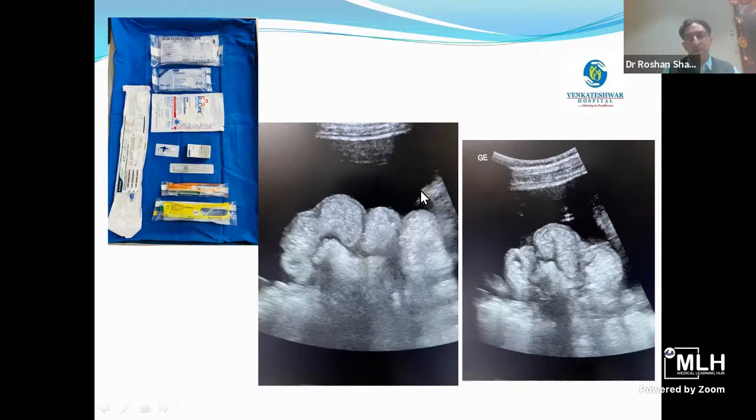So this is the ultrasound image of a patient. The black area is the ascitic fluid, and you can see some bright spots here after putting the needle. We choose the maximum depth. After that, we give local anesthesia, and after waiting for some time for the area to be anesthetized, we put the 16 gauge cannula. Then we withdraw the stylet, and the cannula is connected to the IV set and finally to the Urovac. So fluid drained out. There is less chance of injury to the underlying bowel loops.